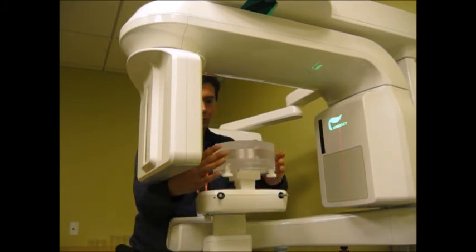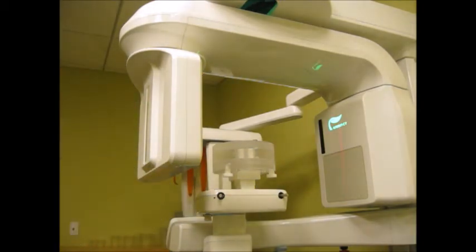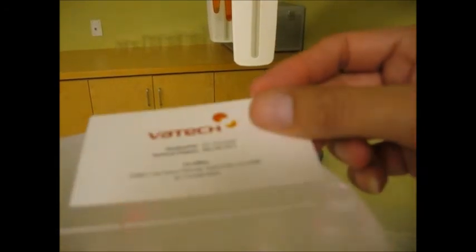Very simple. Okay, my laser, that crossed the middle groove, shouldn't move. Okay, it should still be in the same place, but you can double check it like that. You see, it's still in place, right?